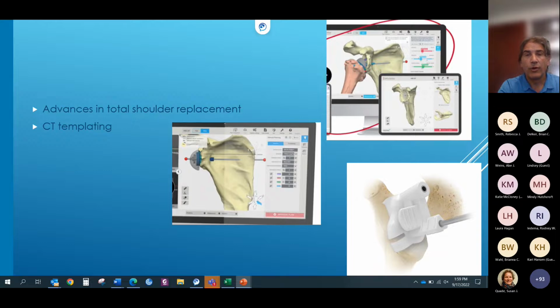And then in the future, for reverse and total shoulder arthroplasty, and actually it's now, but it's not future, but it's a development, is that we use CT scans now, especially on complicated bone loss studies, and we can find out where the bone loss is. There are special implants that we can order that have different augments so that we can replace bone with metal, or you can do a bone graft too and replace bone with a bone graft. But you can actually decide where you're going to put the implants, where you're going to put the central pin, and how you're going to reconstruct it and how much motion they're going to have before you even do any surgery. So it'll show you where you're going to pinch or bind and where bone spurs might be that you need to remove so you don't pinch and bind.